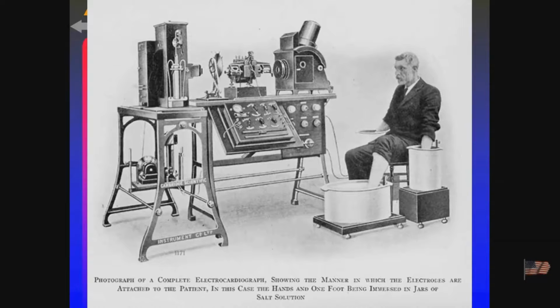There's Mr. Einthoven. This is how he created this concept of doing an EKG. He put his arms and leg in electrolyte fluid to be able to measure the different things. And this was the EKG machine.